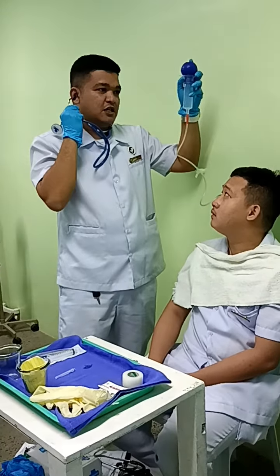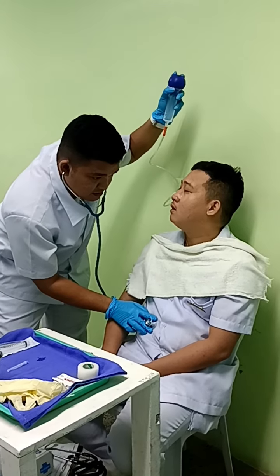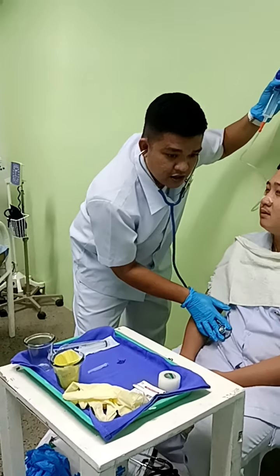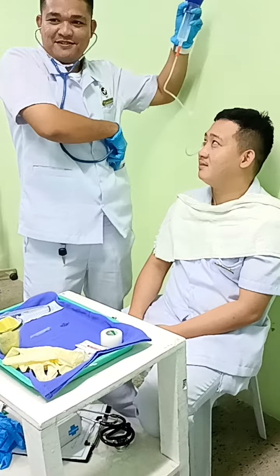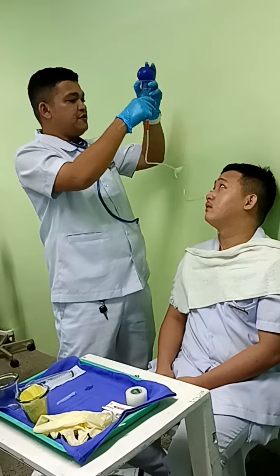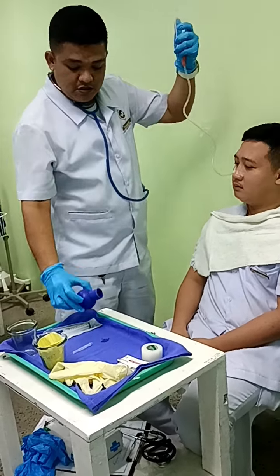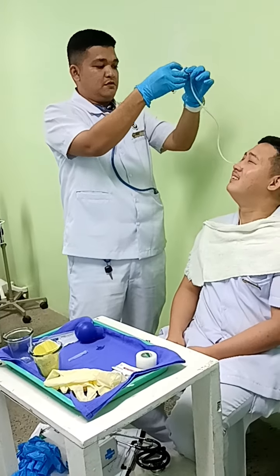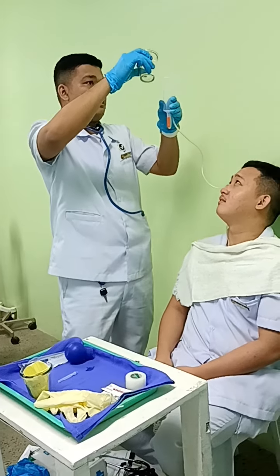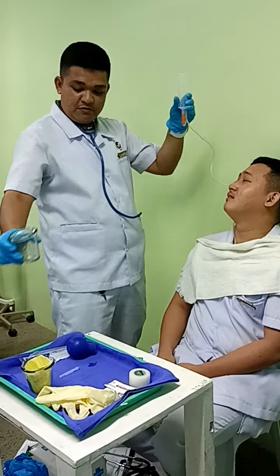So as we pump, we have to listen, auscultate as well. So the tube is in correct place. If there are residues, we have to irrigate it with water. We have to do it step by step, gently, so that the patient will not be uncomfortable.